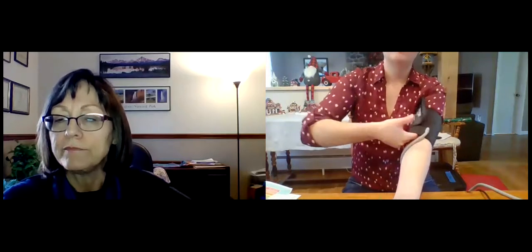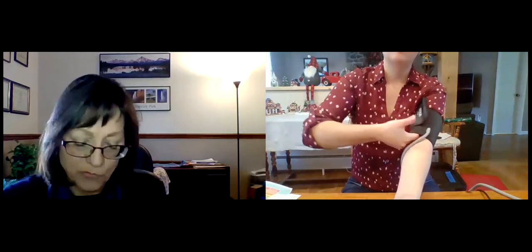Okay, now you're going to check and see if you have it snug enough. So you're going to see if you can get 2 fingers between the cuff and your arm, and it should be pretty snug. Okay, yeah. That looks really good. Okay, so great. Now's the point where you get to take advantage of that quiet time. You're in your chair, you're sitting right, and you've got your cuff on. Now you're going to take 5 minutes to just sit in your chair and rest.